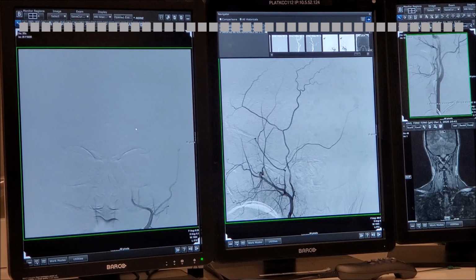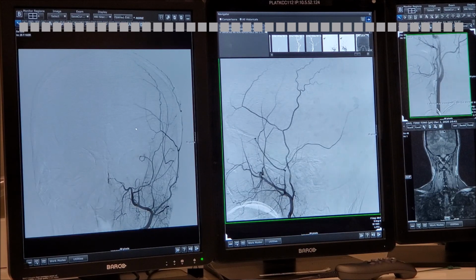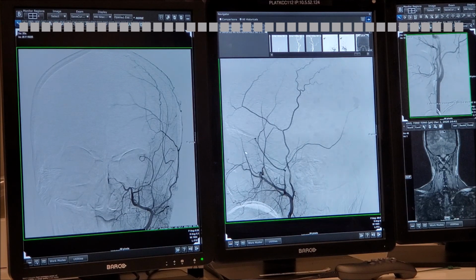Look at that. Look at this middle meningeal behavior. Okay, look how fabulous. You see this? What is this? From the spinosum, so that's middle. I'm identifying my arteries. That's my middle meningeal artery. This artery, look at that, very dominant. And here is the petrosal branch. So one of these two may supply the seventh nerve. But what about the orbit?